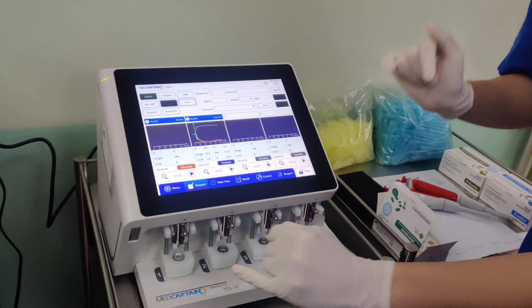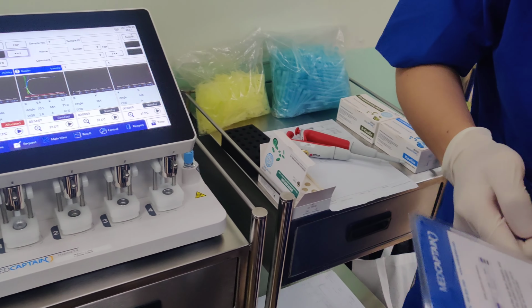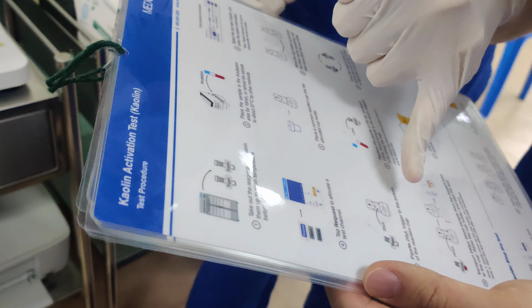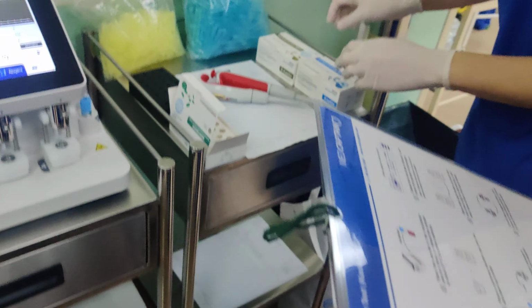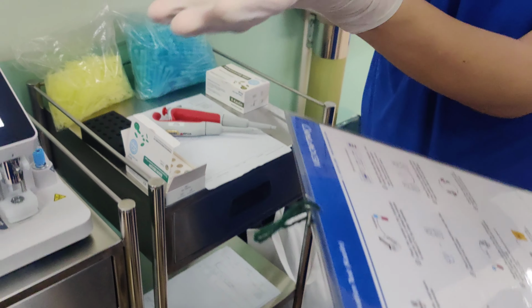So now we can add the reagent inside this cup. Okay? So this is the process I did. Move the cup up and squeeze. Okay? Next, we pipette 20 microliter of trigger. Okay? What is the trigger? So since we are running kaolin test, we have a kaolin test kit.